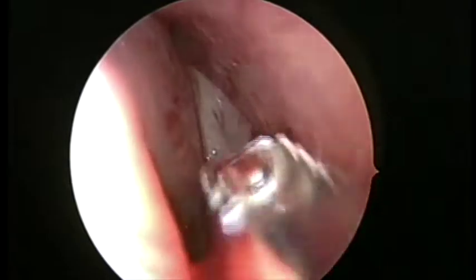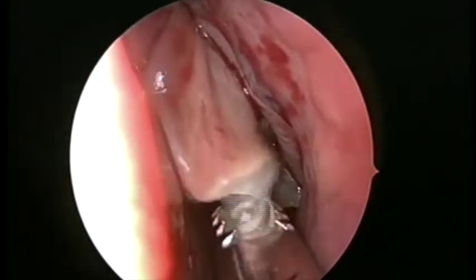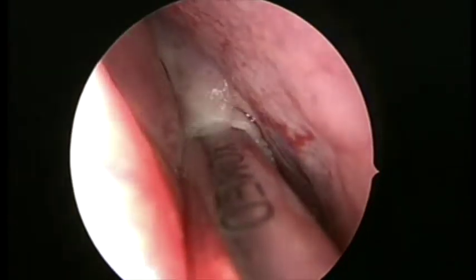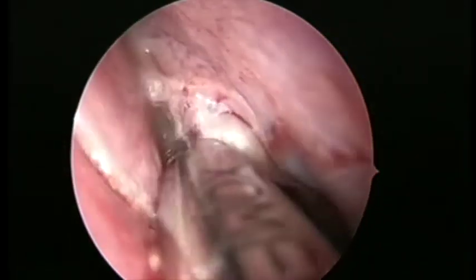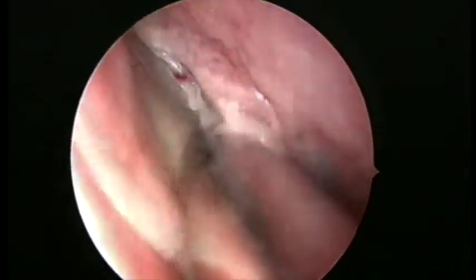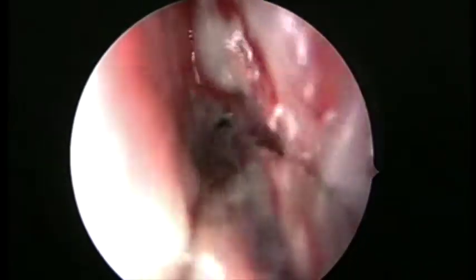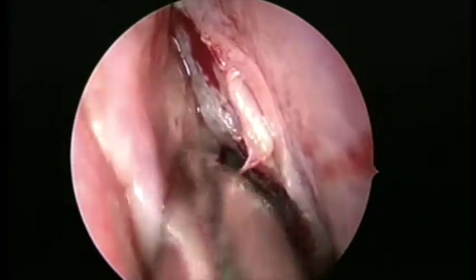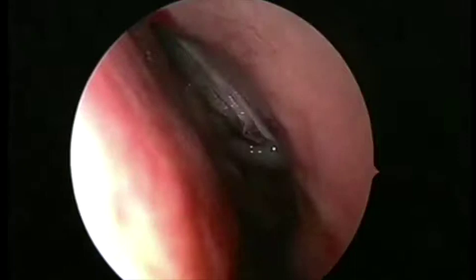I am going to remove the polyp with the microdebrider - it is doing sculpture work. I remove the polyp and go down to the bony landmarks. So here's the polyp cleared so I can identify the rest of the structures. That is the free edge of the uncinate process. Behind here is the ethmoidal bulla, and in this subject you have a very large retrobullar recess. After every step, take a minute to dry the surgical field before doing the next step.